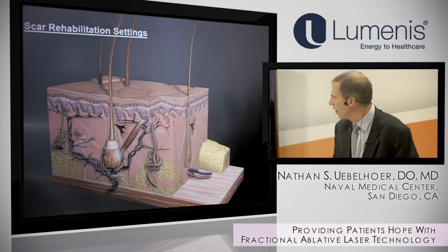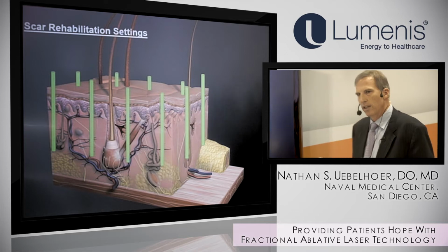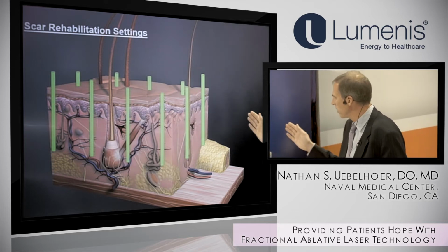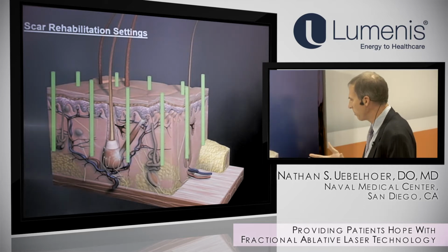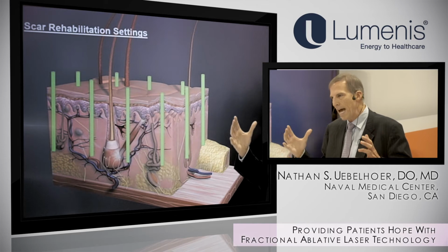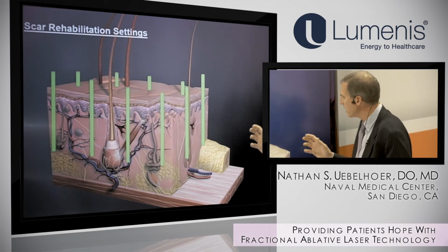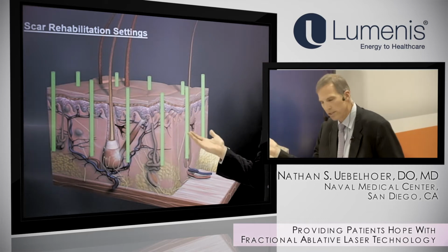But what I'm talking about for rehabilitation of scars is a much different profile, and you're talking about using very thin pulses, like I said before, about 120 microns, and big gaps in between each pulse. So the density is very low. Does everybody understand what I mean by low density here compared to the other?